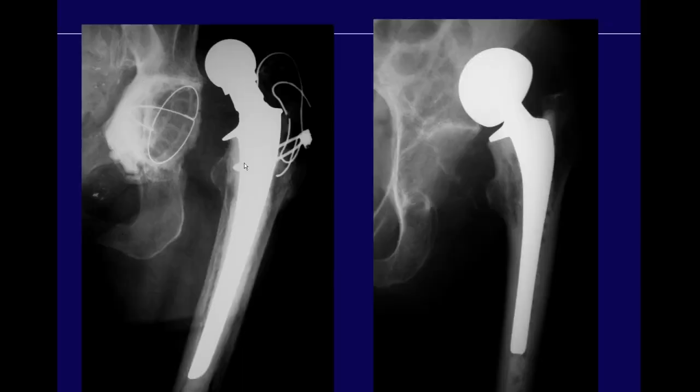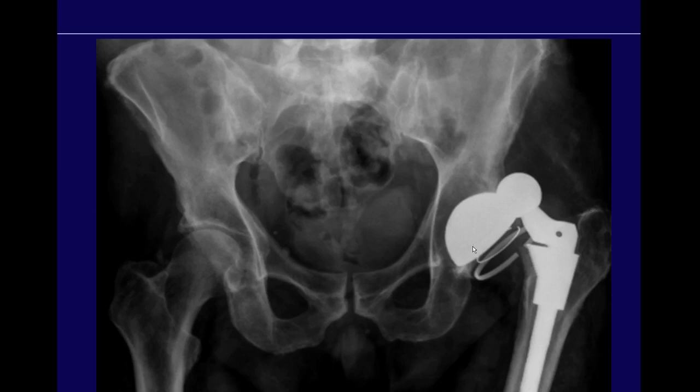This is a late dislocation in a different patient — you can see the reason they dislocated is that the acetabular component is too vertically inclined. In another patient with a bipolar hemiarthroplasty, with enough force that unfixed cup can come out. And even a patient with a dual-mobility constrained liner placed because they are a known dislocator can still dislocate — here the femoral head is dislocated superiorly, and you can see two locking rings, both of which are broken, allowing the head to dislocate out.